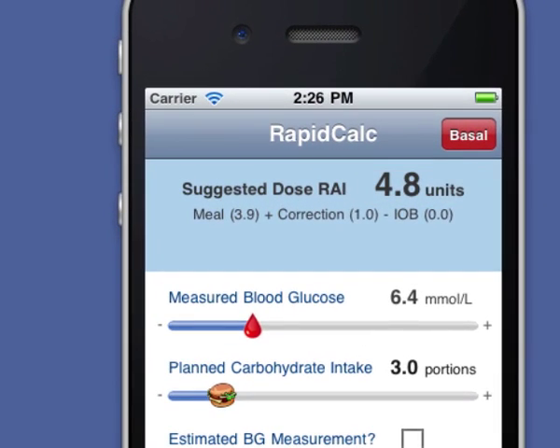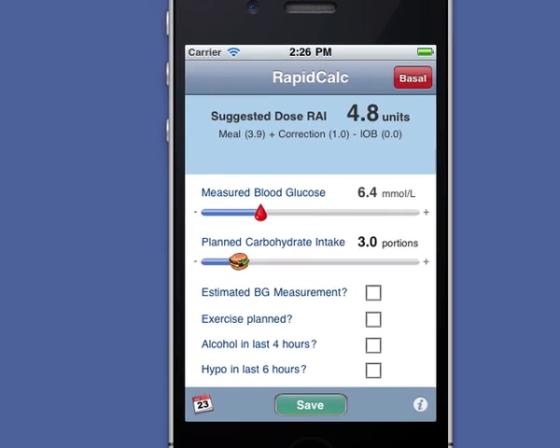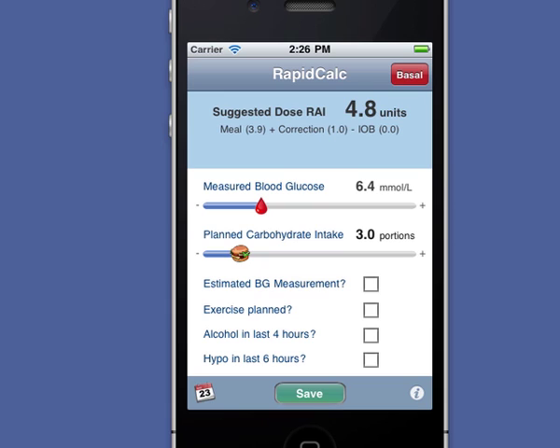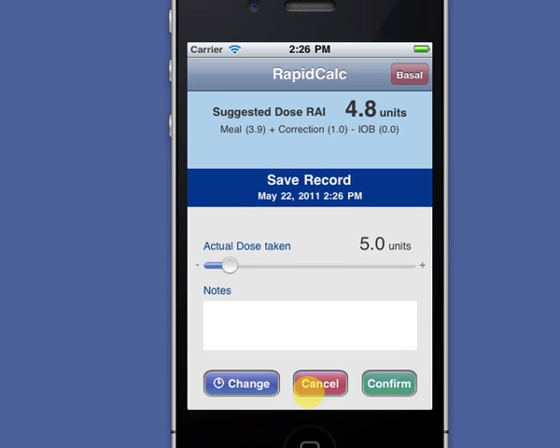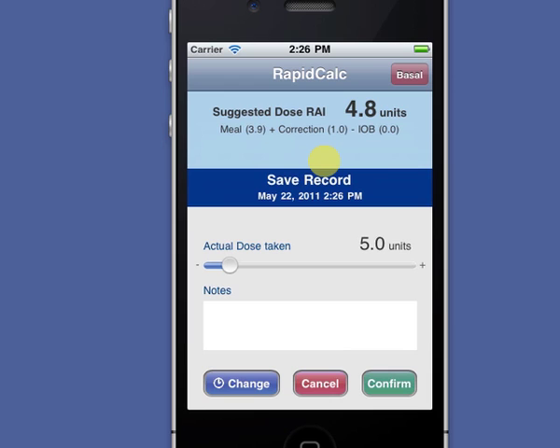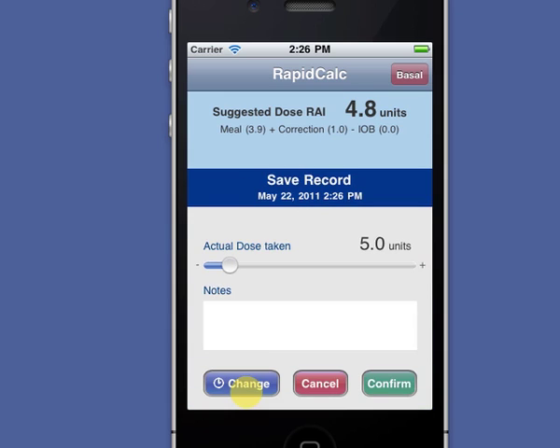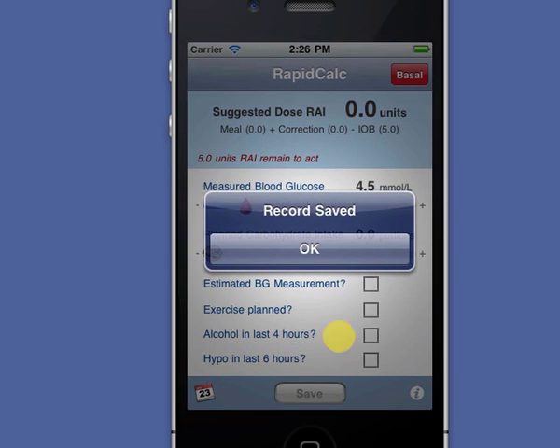I can see that it's made up of meal and correction components, minus any insulin on board still active from my earlier doses. All I have to do is confirm the actual dose I'm going to take, add a note, or adjust the dose time if I want. Then I save the record and that's it.